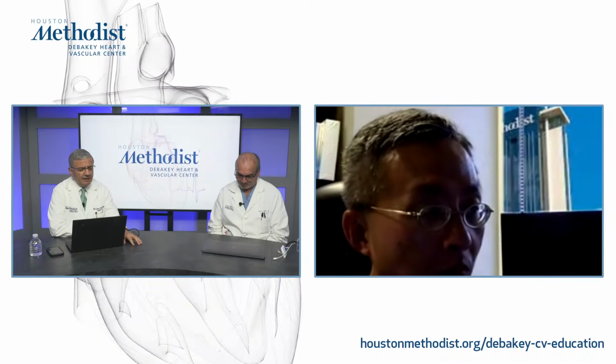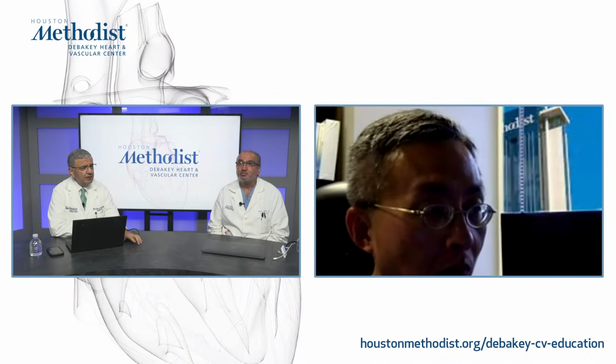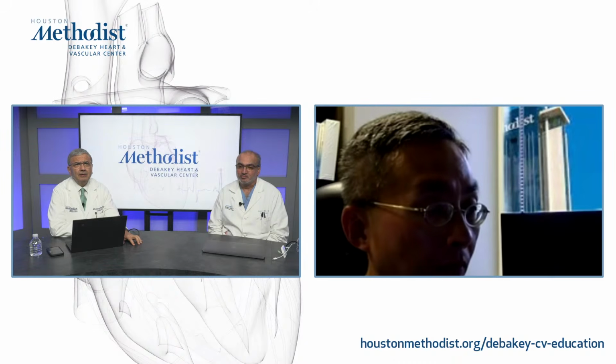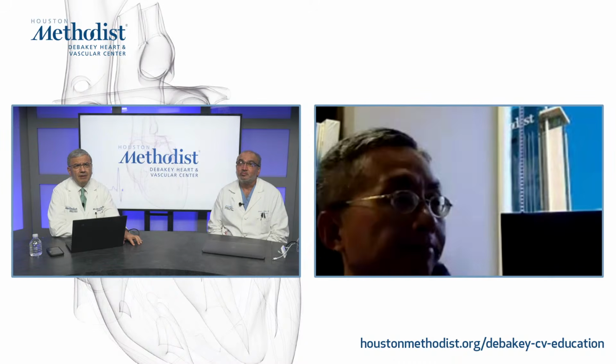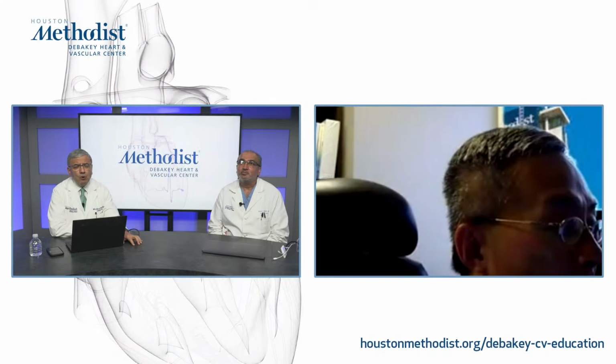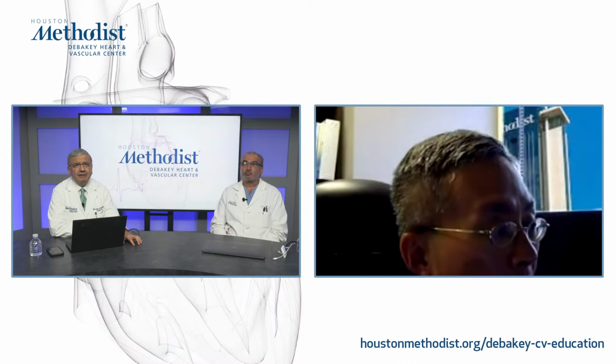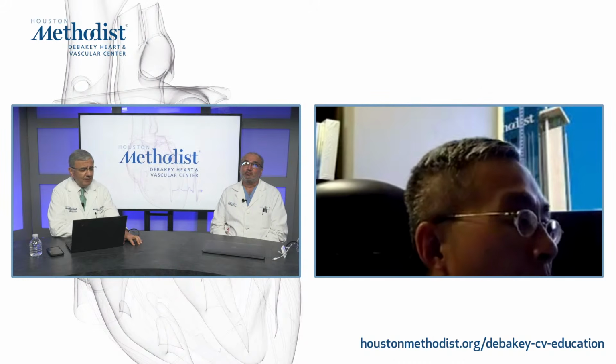I'm asking that question because at times you have patients with advanced renal dysfunction, and the question is, can we tell motion? What can we tell if we look at a prosthetic valve, be it bioprosthetic or mechanical?